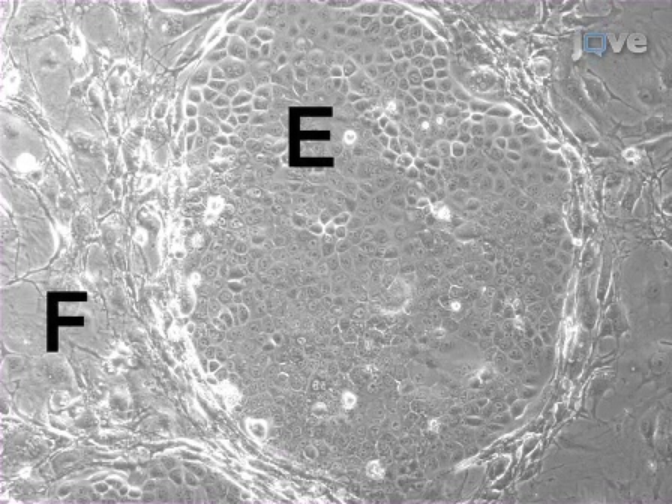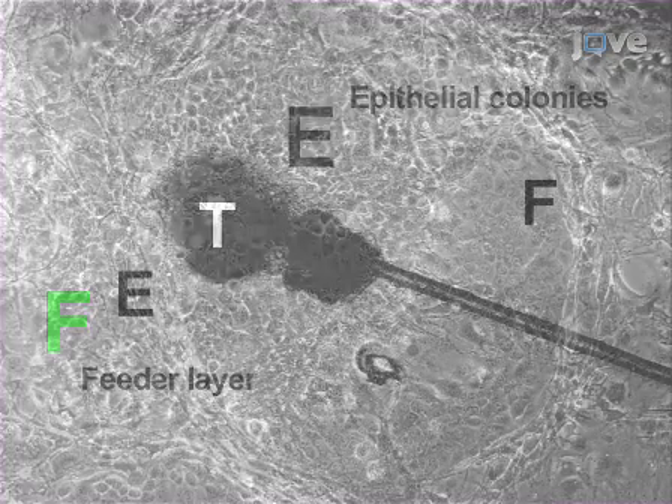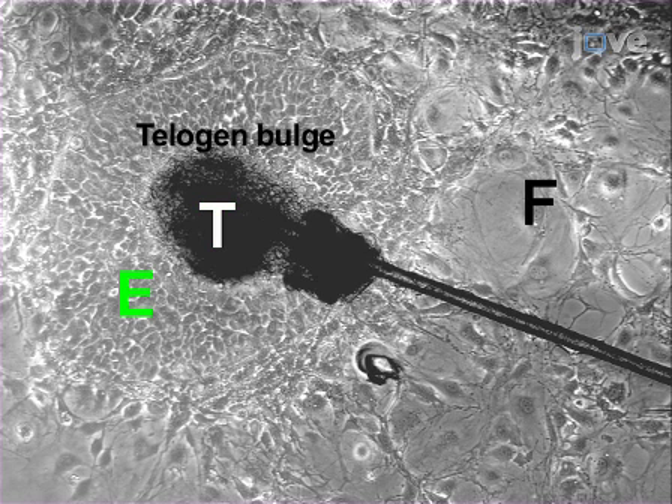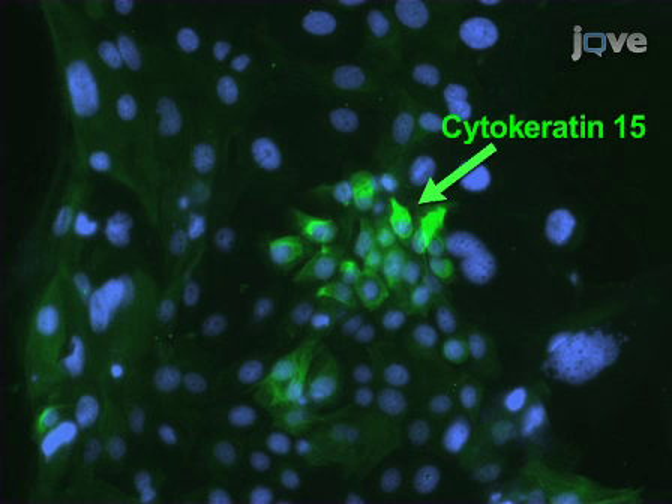In this bright field image, the epithelial stem cells from skin form tight epithelial colonies, designated by 'E', when cultured in keratinocyte medium with a feeder layer of cells designated by 'F'. Shown here are hair follicle explants that give rise to epithelial outgrowths. The telogen bulge region, designated by 'T', is attached to the dish and surrounded by the epithelial cell colony along with feeder cells.